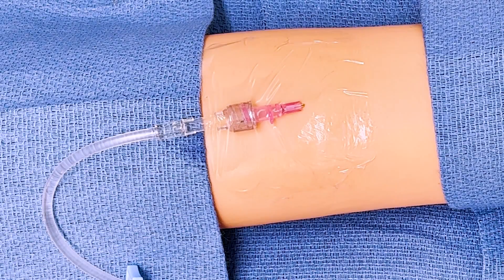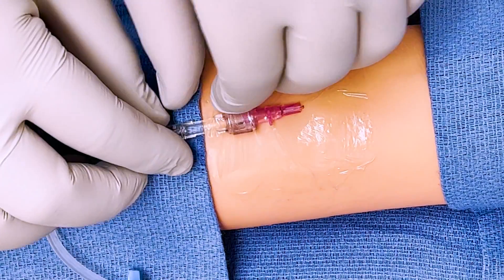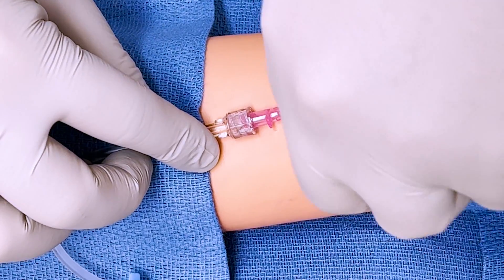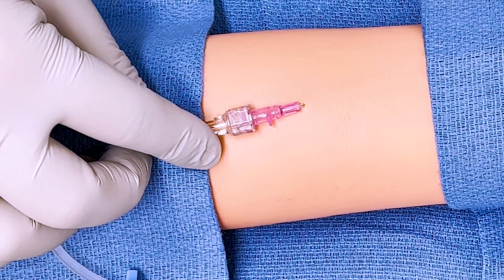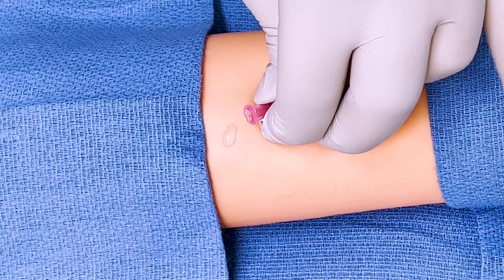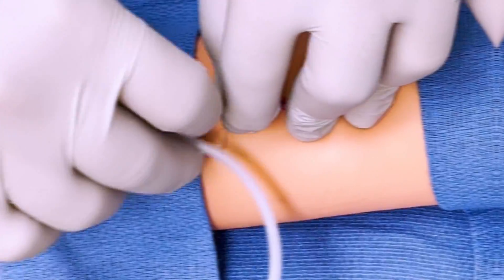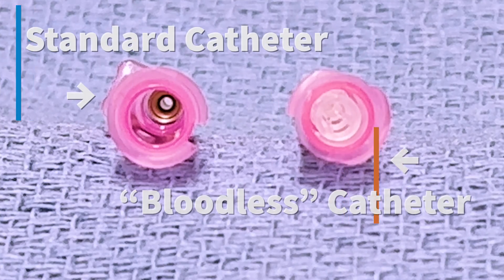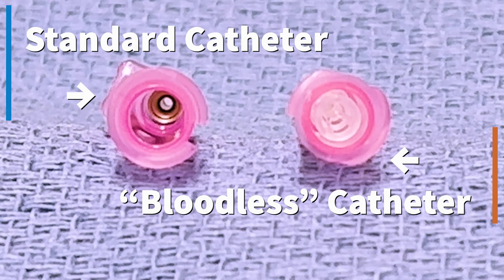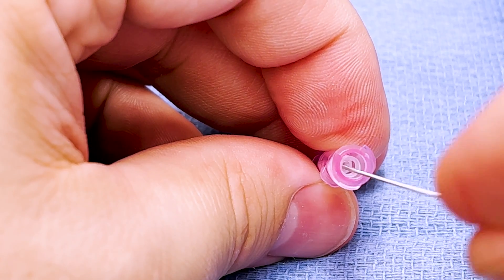You do not need to place a new 20-gauge IV catheter for RIC line placement. Using an existing 20-gauge IV that's been placed in a large antecubital vein is the perfect scenario to upsize to a RIC line — simply take down the dressing, remove the IV tubing, and place the guide wire. If you have a choice in 20-gauge IV catheters, try to avoid bloodless-style catheters, as the diaphragm that prevents blood backflow may also catch the guide wire in the hub, complicating guide wire threading.